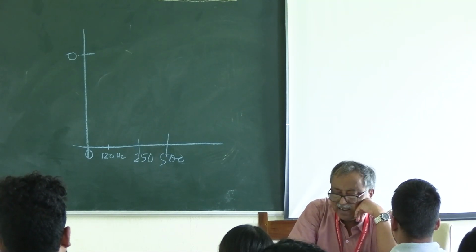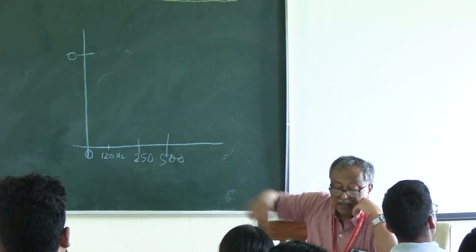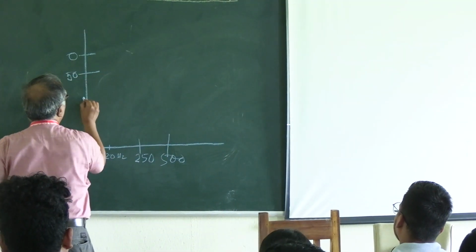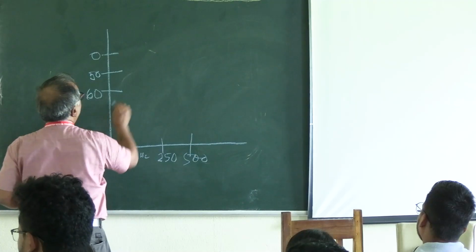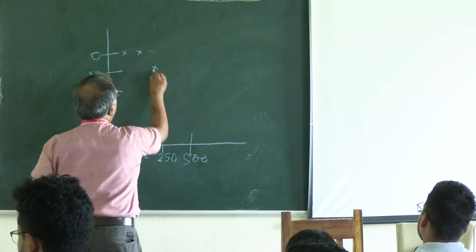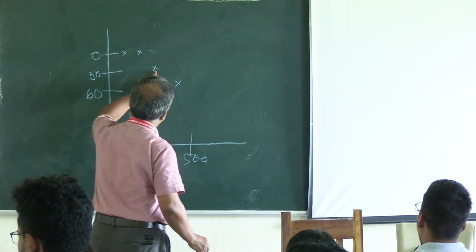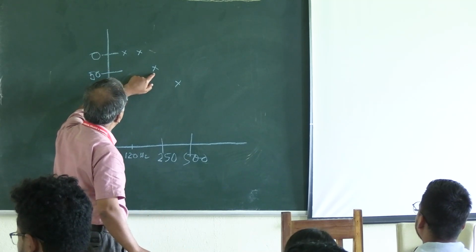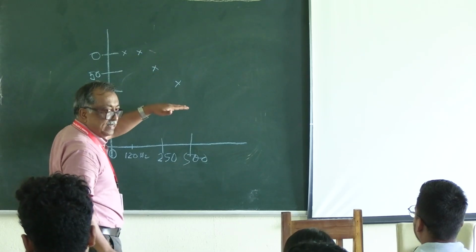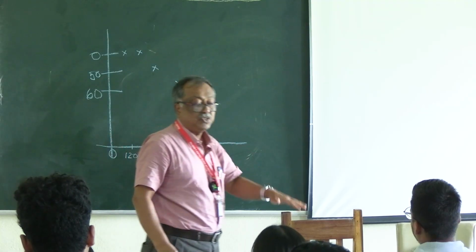When we describe any threshold difference, we look at the change, that it may be here 50 decibel, here may be 60 decibel. Suppose the curve is going on, suddenly the curve is here. That means in that frequency, the threshold is increased to 50 decibel. That means more intensity, more power is necessary to produce the sensation.